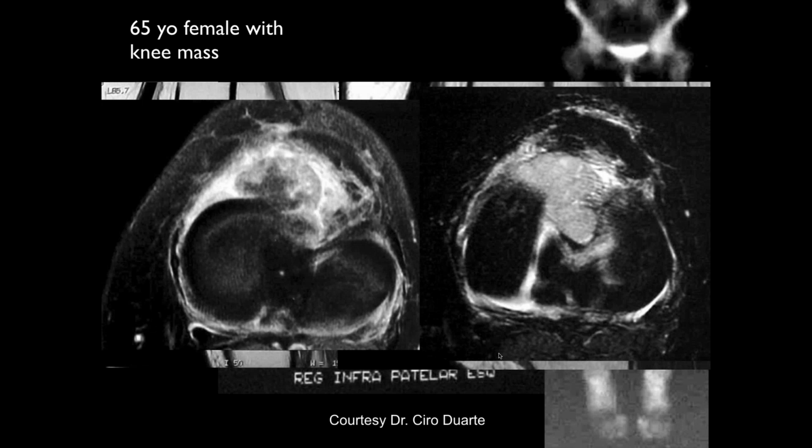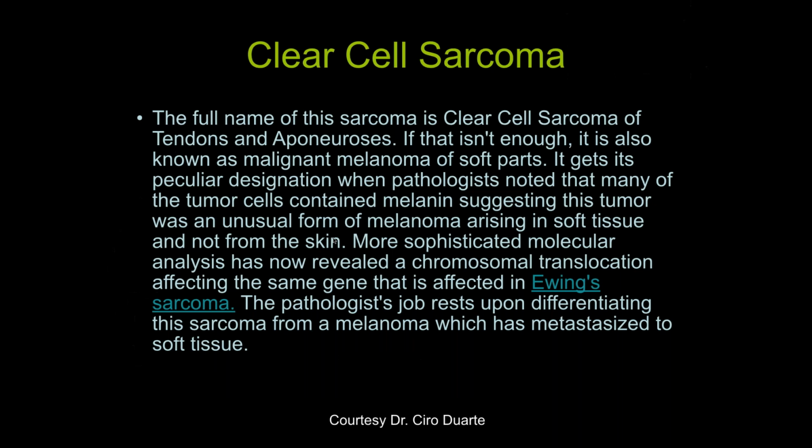Okay, there's that. Here are the axial images. So axial PD fat sat images, and is that post contrast or maybe not? To be honest with you, I don't know whether this is post contrast or not. It might well be. I think we're seeing similar information. Assume this is T1 post contrast, and this is a PD fat sat. So possibly some enhancement, peripherally within it.